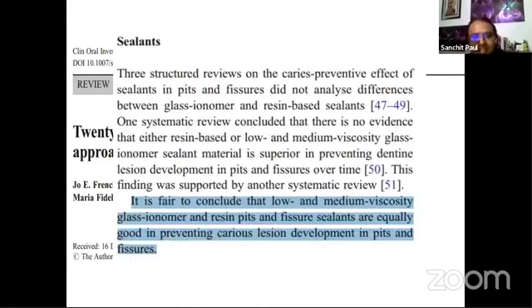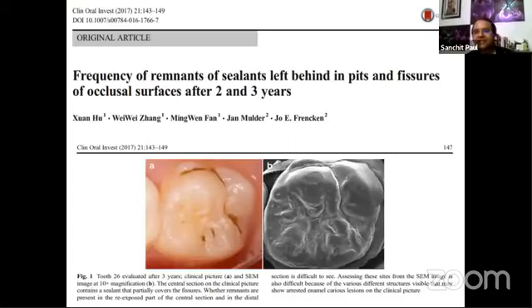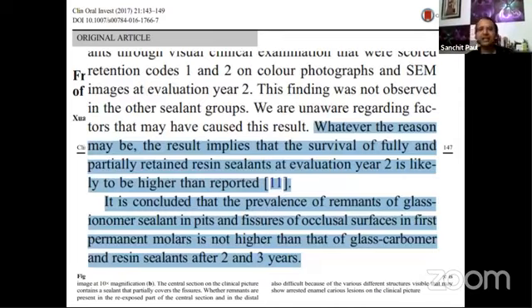Now, some literature has started highlighting that, as we mentioned, the low and medium viscosity glass ionomers, which is either a glass ionomer based sealant or your resin modified GIC or your conventional type 2 GICs, can act as an equally good Pit and Fissure sealant if we compare to the resin sealants. The advantage of these sealants is that even if they are left behind or dislodged, there would still be some fluoride releasing, which would protect that tooth surface compared to the resin sealant only.